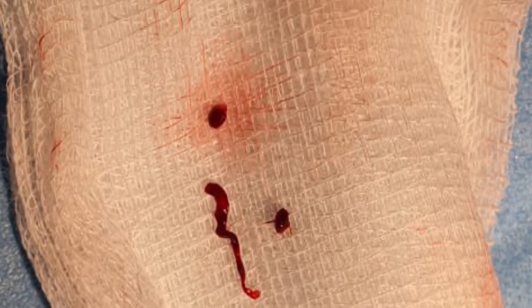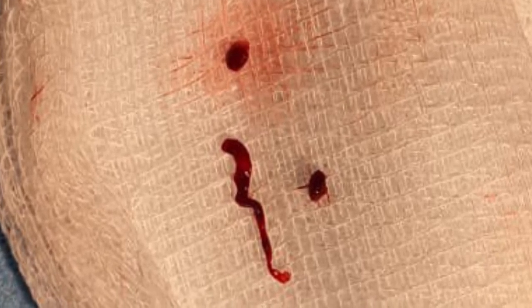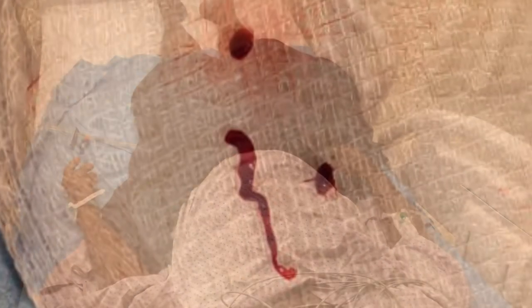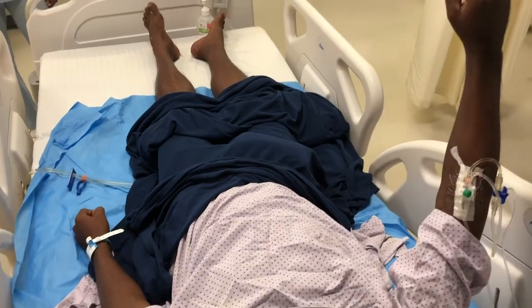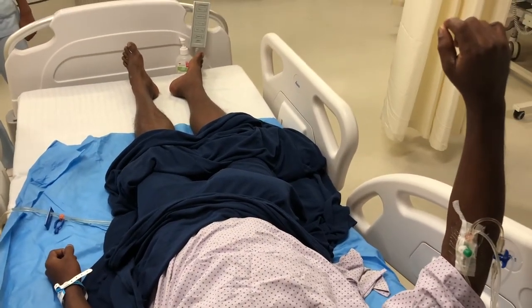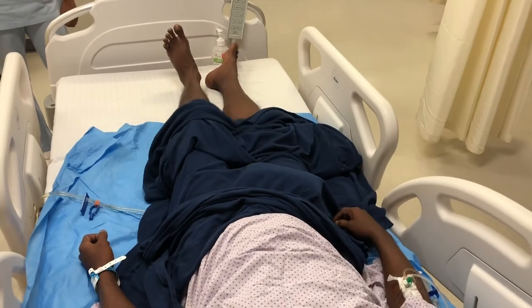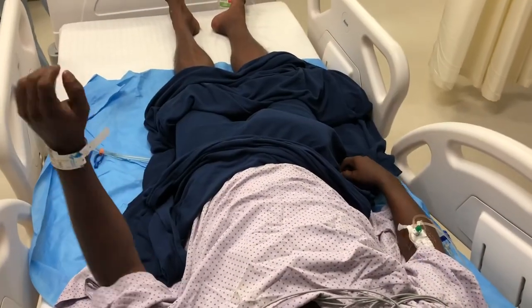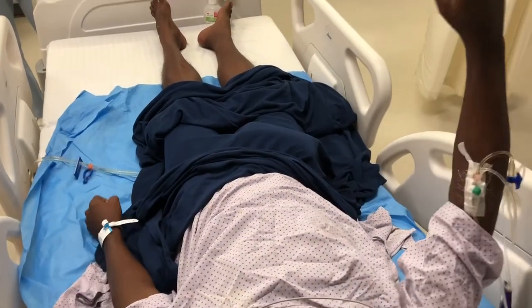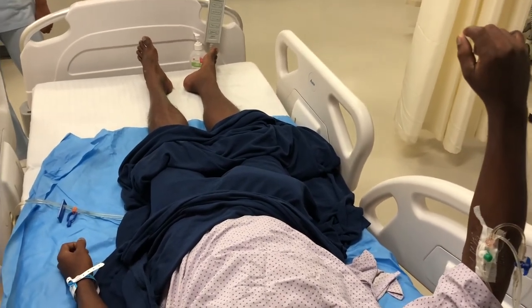This is the clot which was taken out using the stent retriever. And this is the patient one hour after the procedure in the intensive care unit. The patient is able to lift the right upper and lower limb almost normally. Speech has improved significantly, and right lower limb power has also improved.